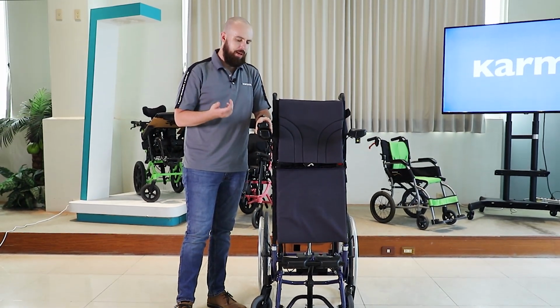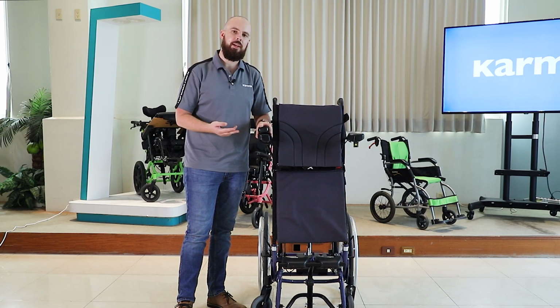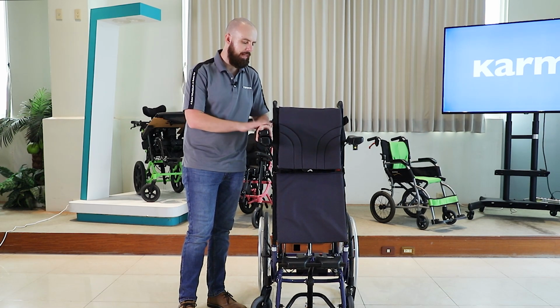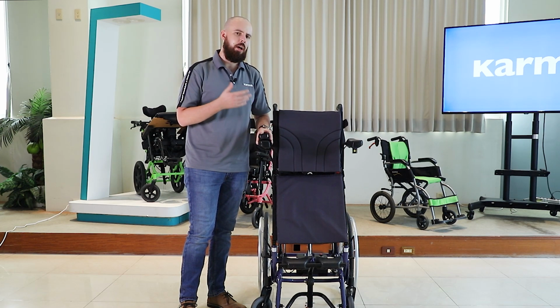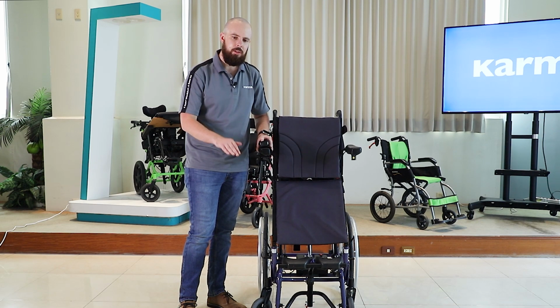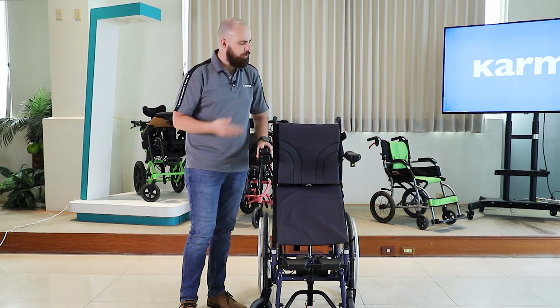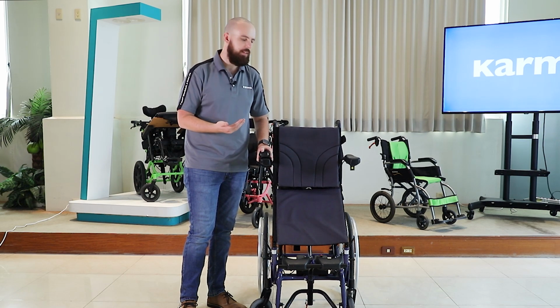And if you're wondering about the length of the batteries on this, there are two 2.9 amp hour batteries powering the SME. Now those will last about 120 cycles. So a cycle means you're in the seated, stand, and then seated again. That's one cycle. So we can do that 120 times before those batteries die.